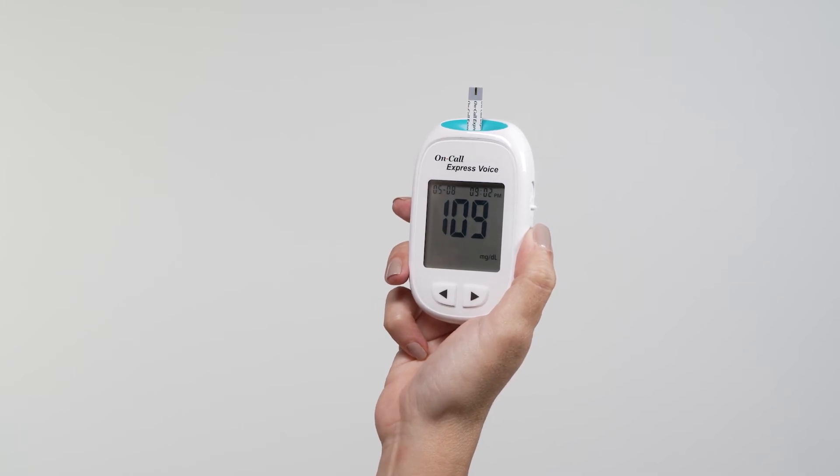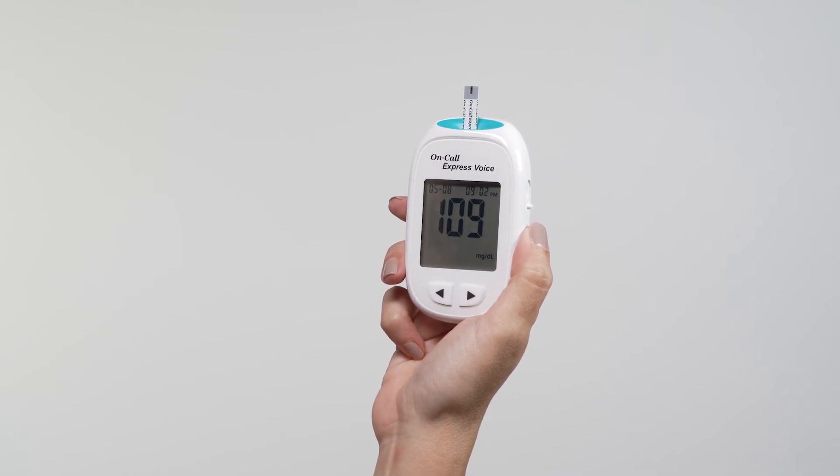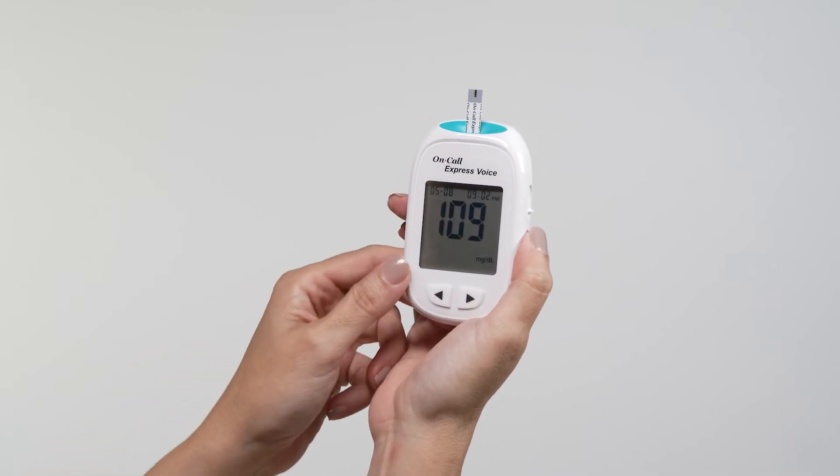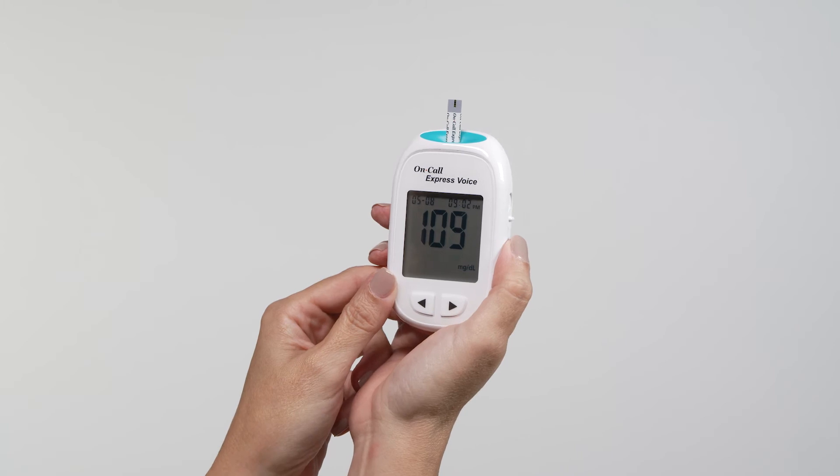Then the blood glucose level will be voice broadcast and the display on the screen will indicate that measurement is complete. The measurement's unit, date, and time of the test will also be displayed.